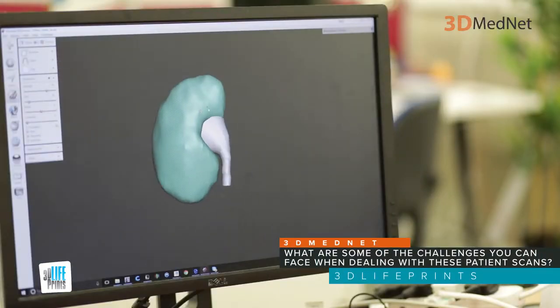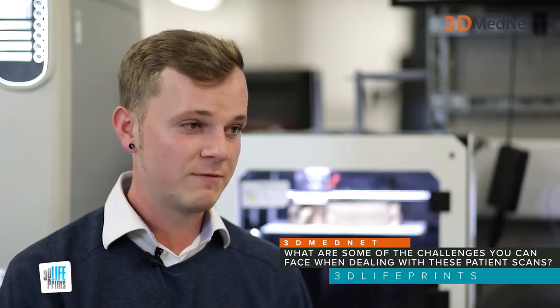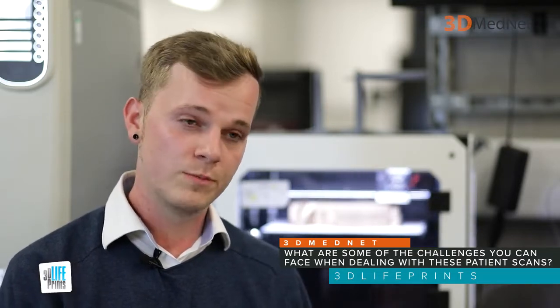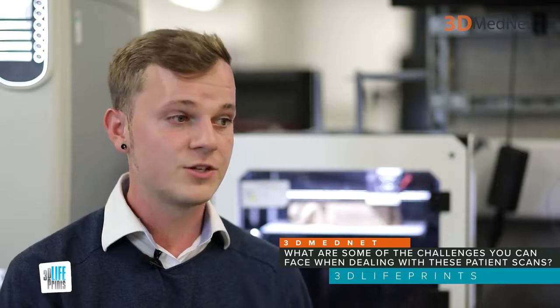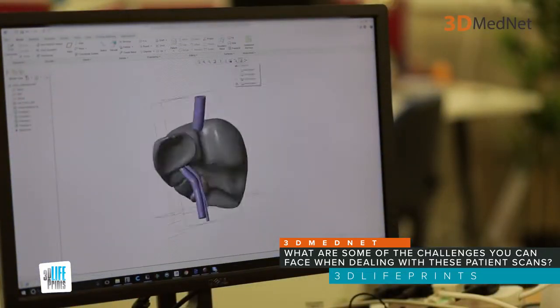In imaging, especially in pediatric imaging, there are a number of challenges you can come across. Some scans, like MR scans, can take a long period of time, and when you have little kids moving around in a scanner, you can sometimes get loss of detail in the scan or sort of a blur, which will eventually affect your 3D model, as the 3D model, for anatomical purposes, is faithful to the scan.